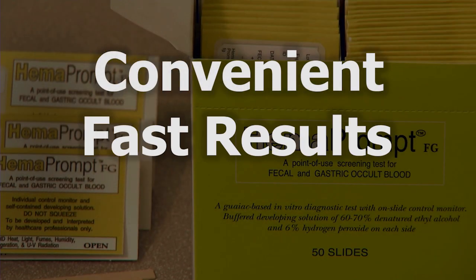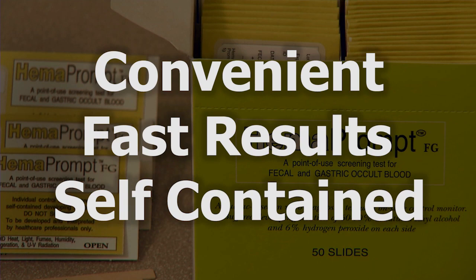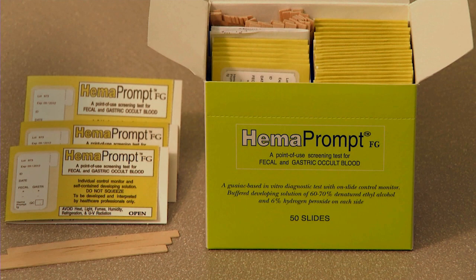Convenient, fast, reliable results. Self-contained developer. That's HemaPrompt FG.